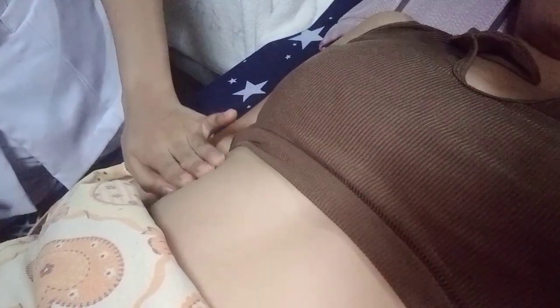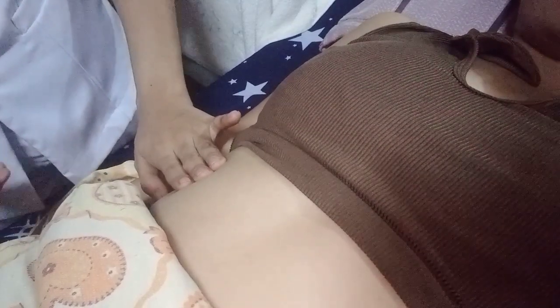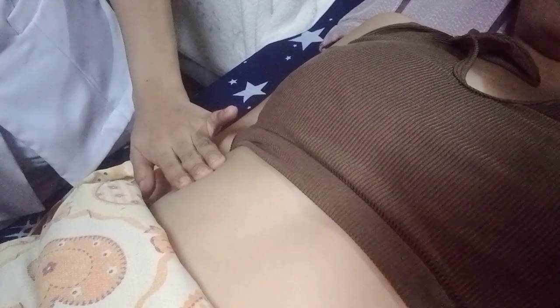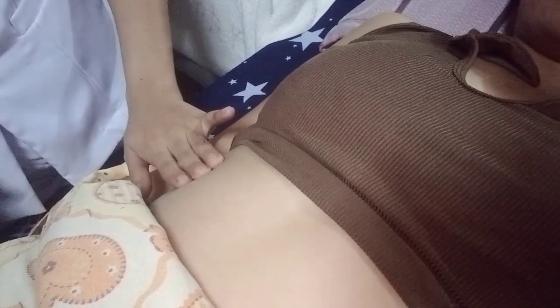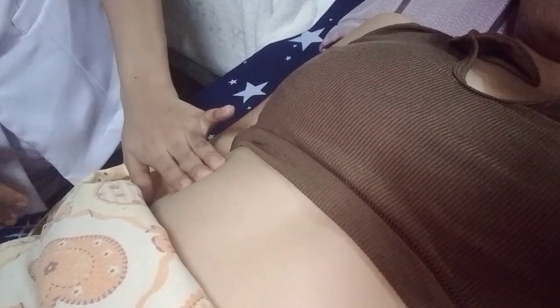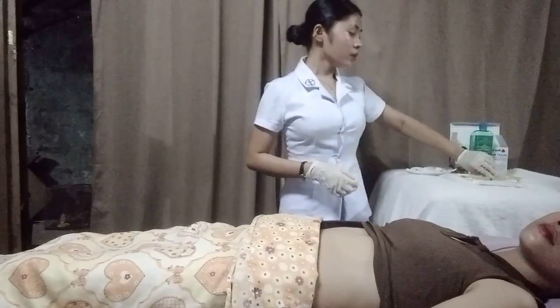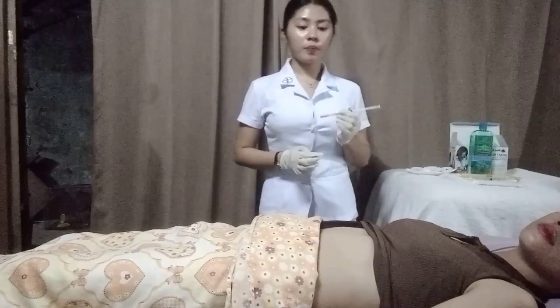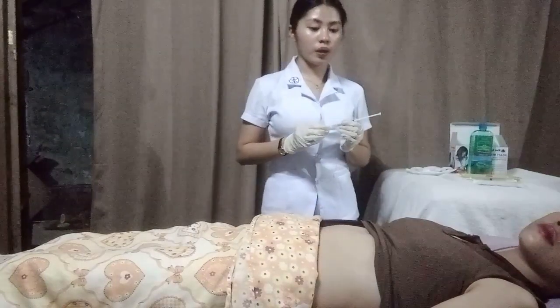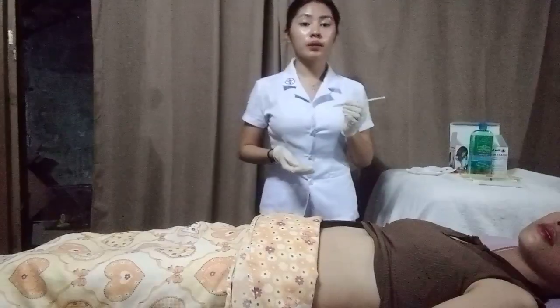No. Okay, and to make sure that you have the right size of the needle, use the thumb and finger of the hand to grasp the skin fold of the tissue and measure the fold from the top to the bottom to ensure that the needle is half as long. Now, pull the needle cap and hold the syringe between the thumb and the forefinger as if you are holding a ball pen.